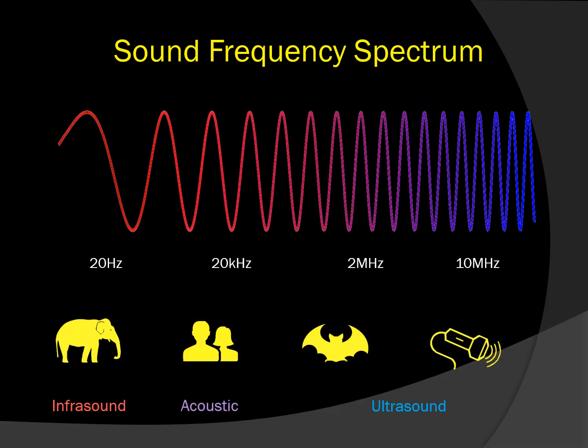A little bit behind the physics of ultrasound, the probes that are used in ultrasound produce sound waves that travel through various mediums, whether air or parts of the body. A hertz is defined by 1 cycle per second of sound waves. In medical technology terms, the probes will produce sound waves between 2 to 10 megahertz.